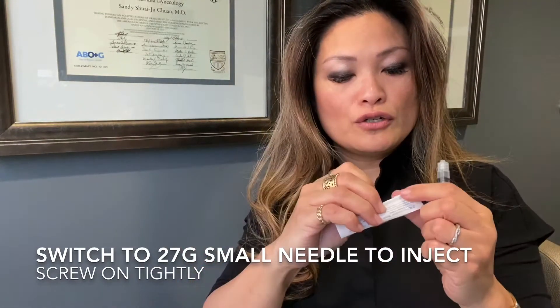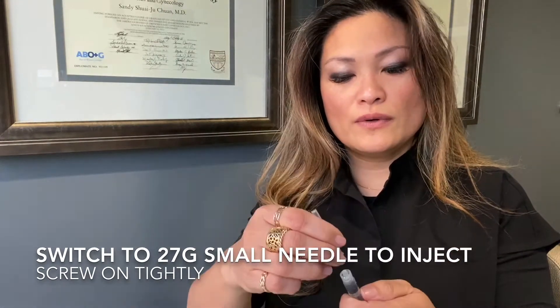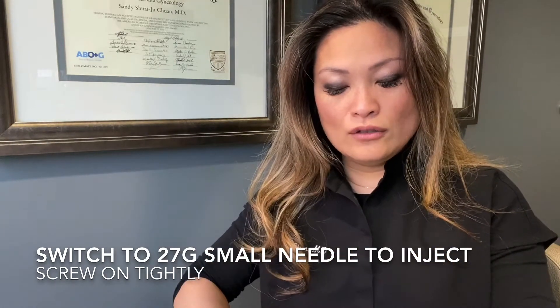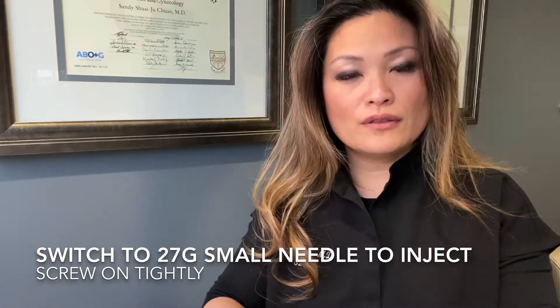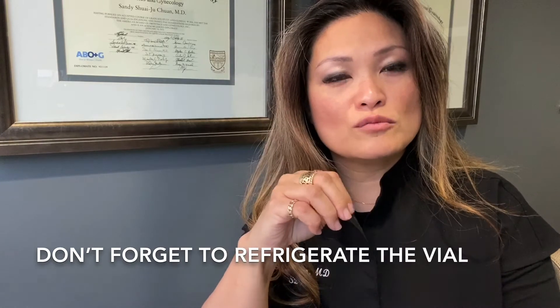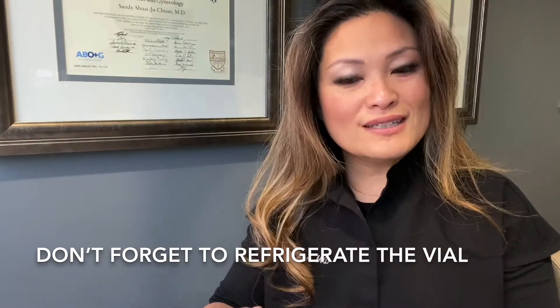Switch out to the smaller needle — you want the 27-gauge needle, which you normally use for injections. Twist it on and you'll be ready to inject. Make sure you put the extra half ml that's left back in the refrigerator so you can use it tomorrow. Just draw up the whole thing and use it, and that'll be your growth hormone injection.